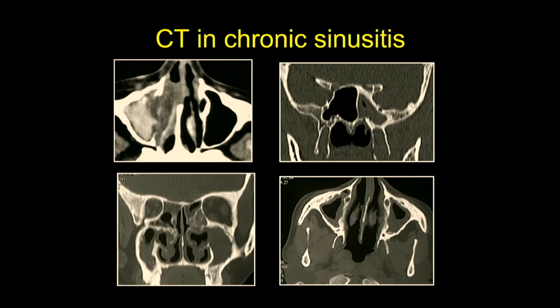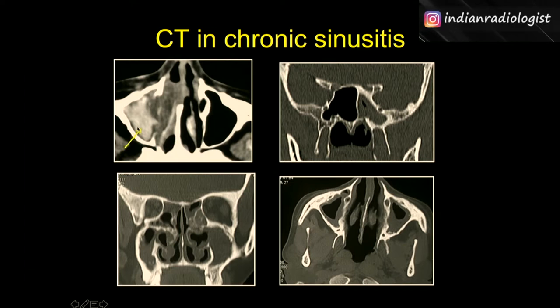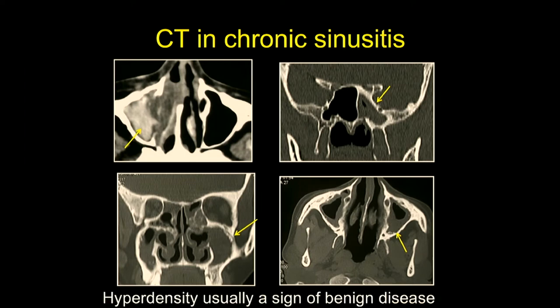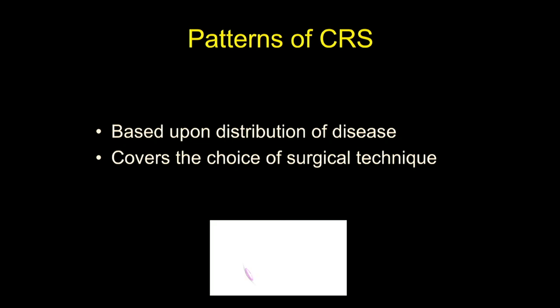Before we go on to understand these patterns, let's do a quick revision of the findings in chronic sinusitis. We could have secretions within the sinuses which could be hyperdense, as we see here. We could have adjacent bony thickening and bony sclerosis, which is a marker of chronicity. We could have certain calcifications which would be peripheral and scattered. Remember, hyperdensity is a sign of benign disease — it basically excludes tumor. The other causes of hyperdensity being fungal infection and hemorrhage.